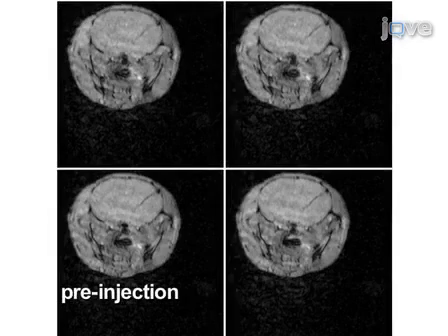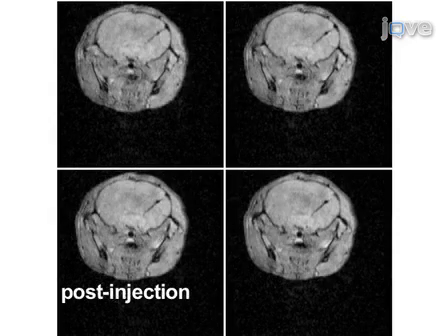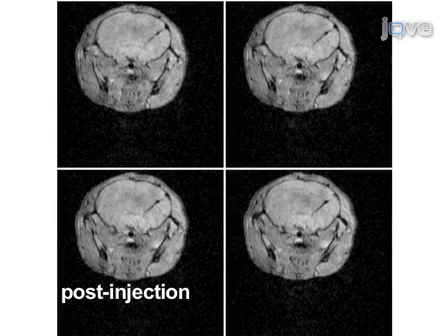Superparamagnetic iron oxide causes signal loss in T2 star-weighted MRI, and, as such, the MRI signal void is a sensitive but not specific marker for its presence. To provide both sensitivity and specificity for the presence of SPIO in the brain, subtraction images should be created from the pre- and post-injection 3D MRI scans.